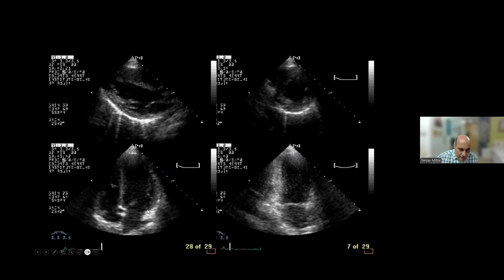In the same way here, if we look at this four-chamber view, we would rank this segment as basal septum, right? Mid septum, apical septum, apical lateral, mid lateral, and basal lateral. You can see the papillary muscle head. But be cautious about this thing. This is aortic valve opening. And if the aorta is opening, this is no longer a four-chamber view.